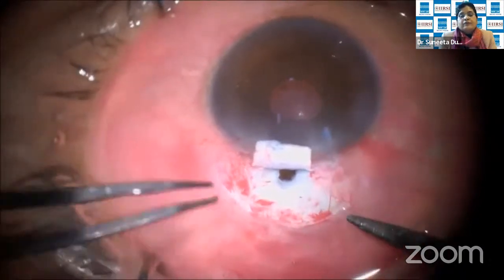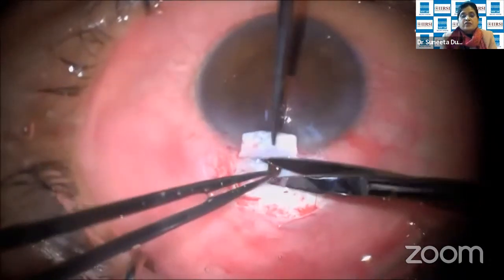So sideways flow will be there. So as far as possible, you could make three marks within 1 millimeter. You have 2 marks, and right in the center you have 1 mark. So you are exactly in the center. Dr. Anil Mandal's surgery demonstrates that very well, where you have to make the marks.